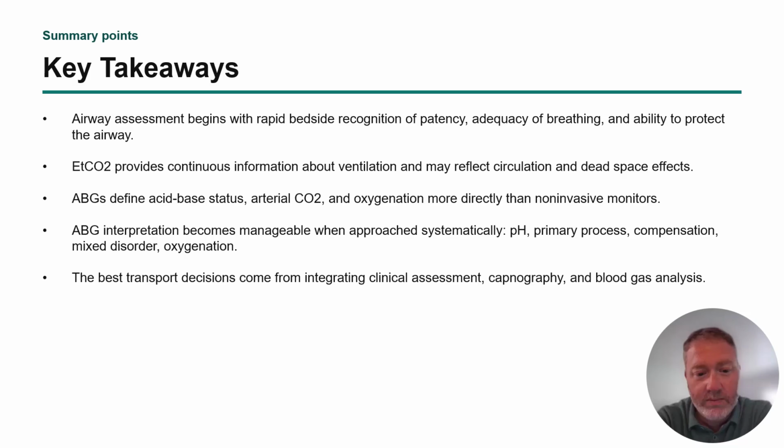ABG interpretation becomes manageable when approached systematically, and being able to look at a blood gas and not only know what it is but know what to do about it is supremely important in the transport environment. But the best transport decisions come from integrating all of these things and looking at the big picture with the patient.